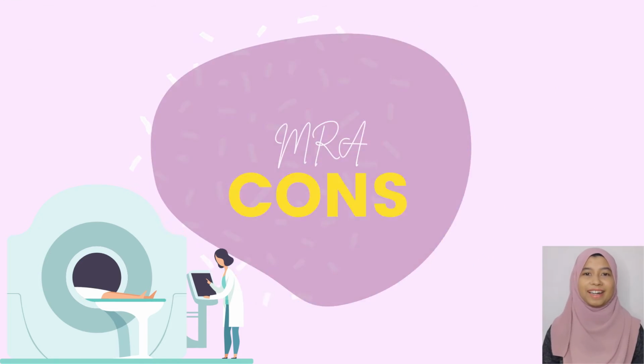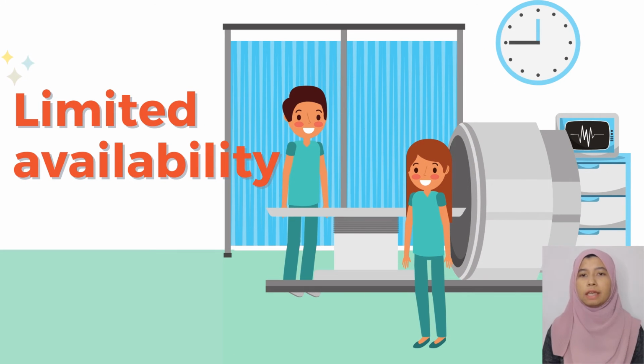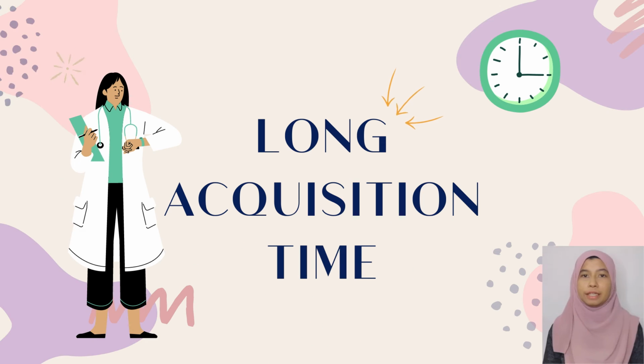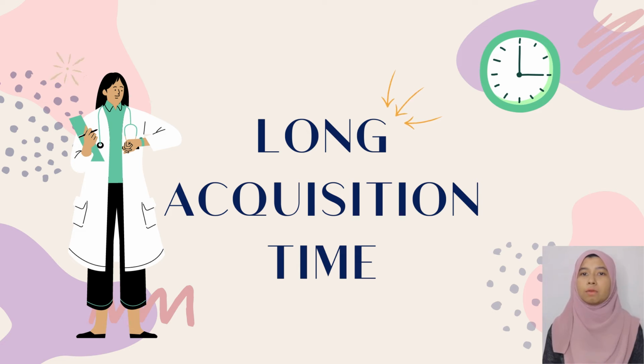One of the cons of MRA is limited availability. Even though the capability of demonstrating aorta in diagnosing aortic aneurysm is immaculate, it is only available in a big hospital. MRA also has a con where it has low temporal and spatial resolution compared to angiography itself, where MRA may not detect the subtle stenosis and wall irregularity. Besides, it also has long acquisition time, which is why it is seldom used in the emergency state due to the need of rapid diagnosis and the patient in a critical condition.